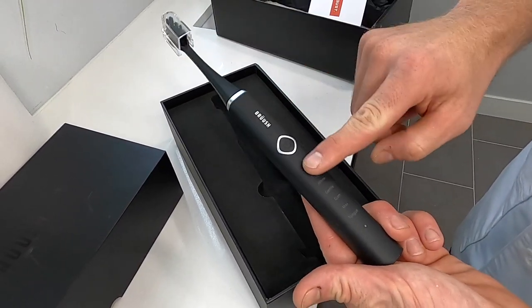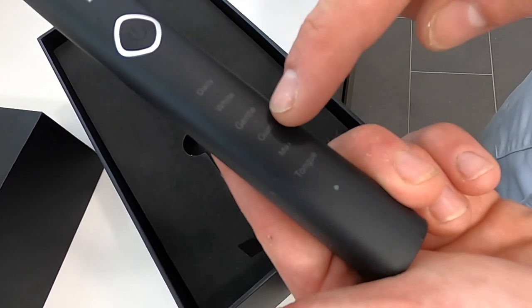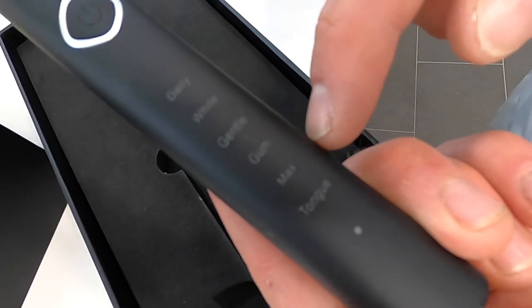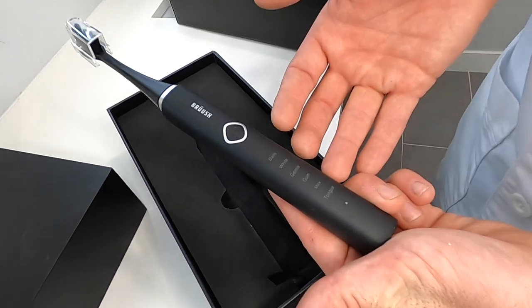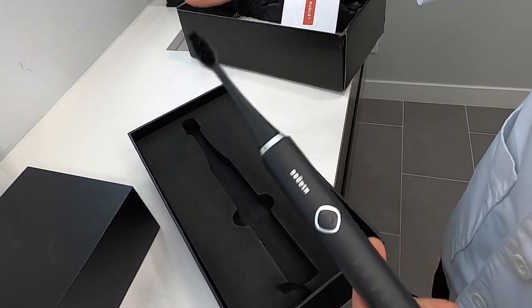This thing has six different modes: daily, white, gentle, gum, max, and tongue. I think it's a little bit excessive and confusing, but it's a fun feature that they've built into this toothbrush.